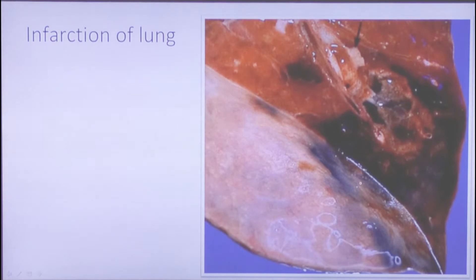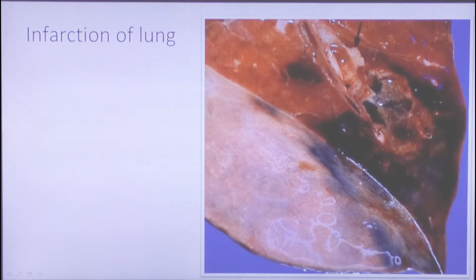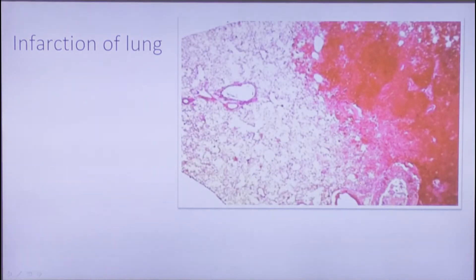This is lung infarction — a type of necrosis due to vessel blockage. In the lungs it is always a red infarction, due to the special features of hemodynamics in the lung. Microscopically, we also see this red area of infarction.